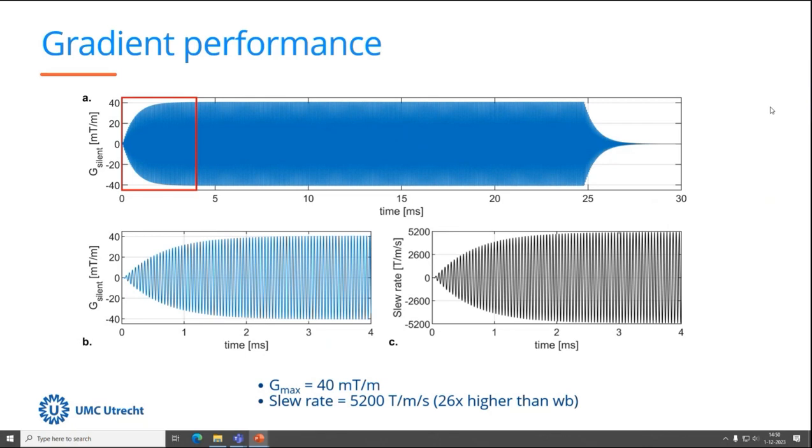Okay, now this is how it looks. Super fast. So this is in milliseconds. Yeah? So imagine usually these blocks are like this. This is when we're reading out these signals.